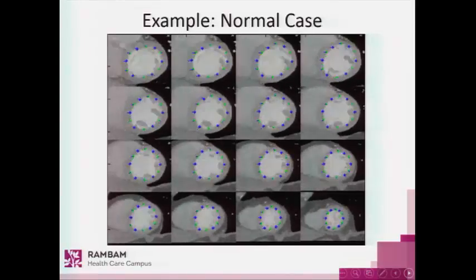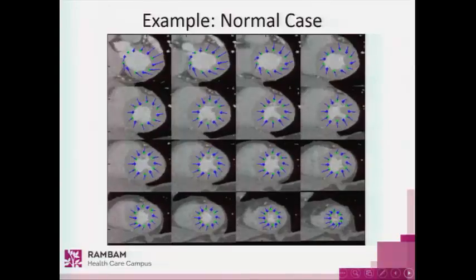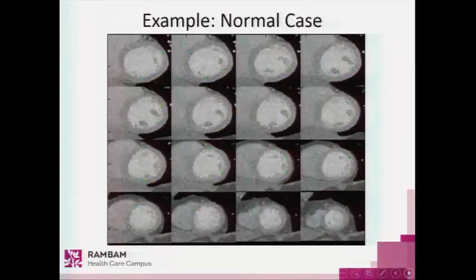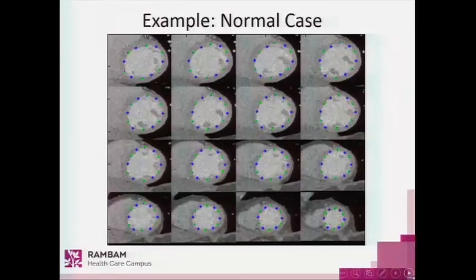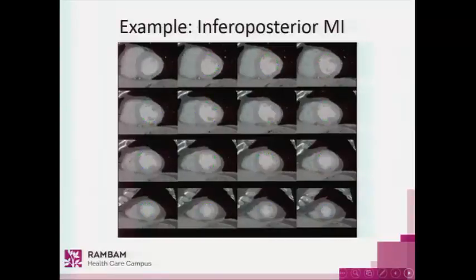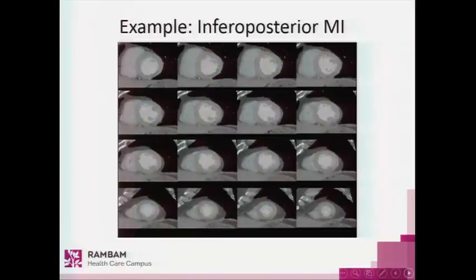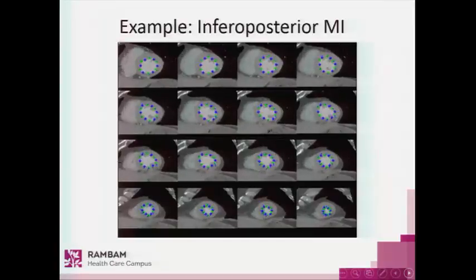This is an example of a normal case. We see that the tracking of the myocardium is very good, and also the contraction is good. This is an example of an abnormal case. The tracking of the myocardium is also very good, but we see hypokinesis of the infero-posterior wall.